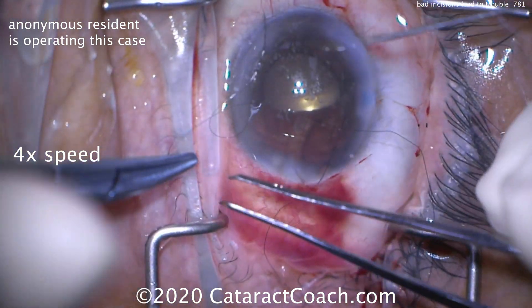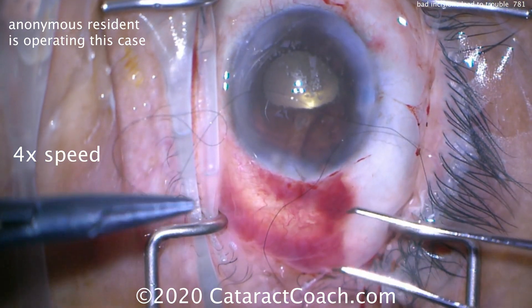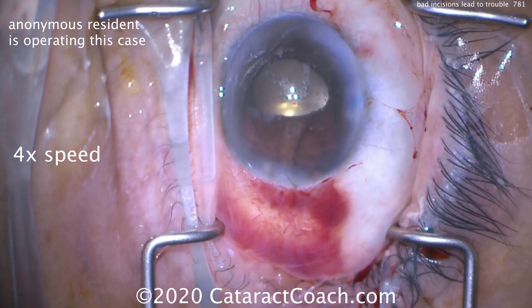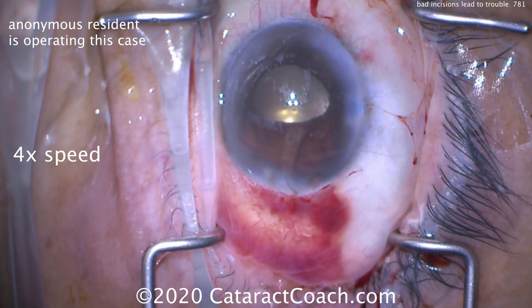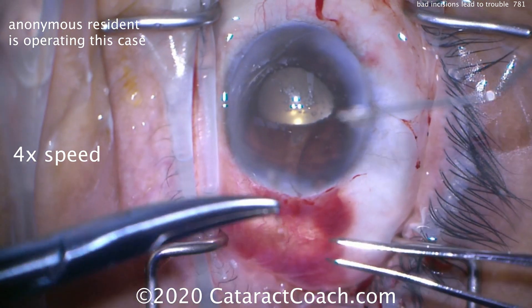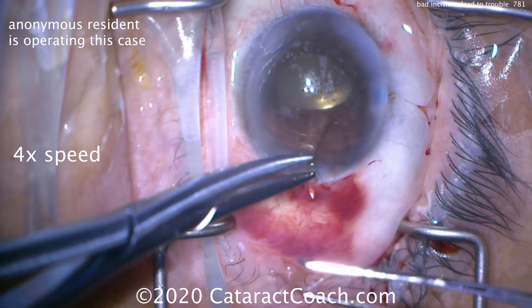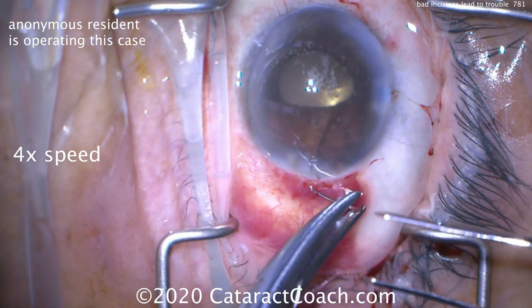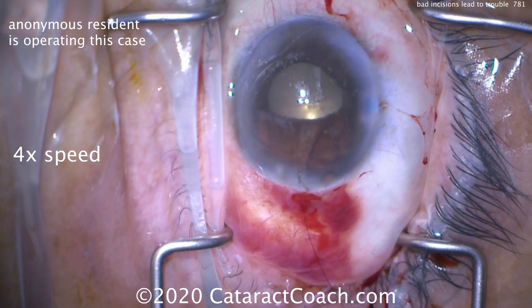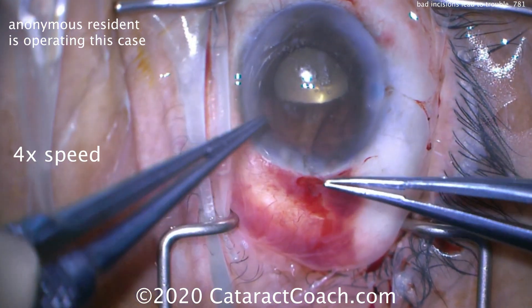This patient will do fine. Looking at the OR table, you see that pupil looks a little irregular. Has the temporal iris been damaged too much from that repeated prolapse? That's a very important question — and in cases like this, it's actually not damaged. The resident is now throwing a 10-0 nylon again to do a better job of sealing that incision. Remember, if you take your time and do another stitch on the day of surgery, at the original surgery, that's normal.